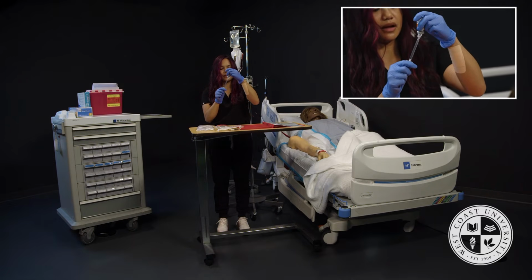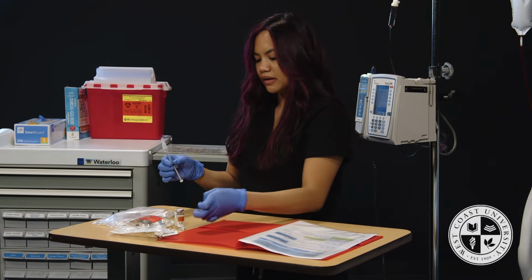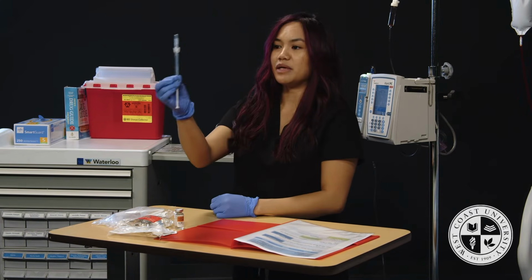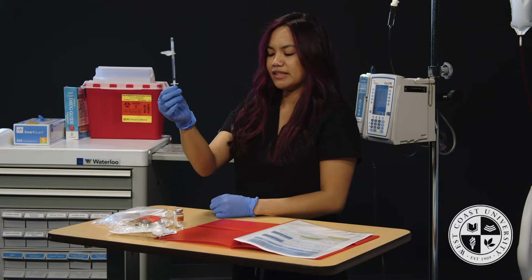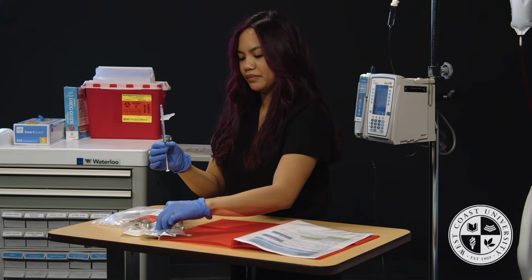I see that I got my 1 milliliter, which is my 5,000 units of heparin. I'm going to go ahead and do a safe scoop. Okay, I'm going to make sure I have my second RN verify the dose. All right, my second RN has verified, so I'm going to go ahead and administer my medication.